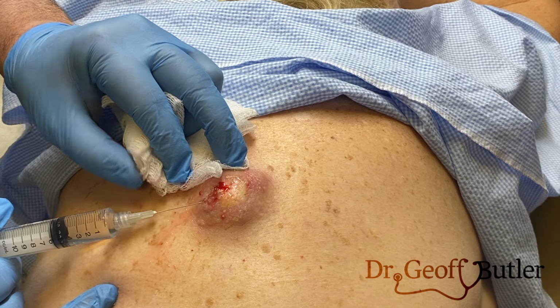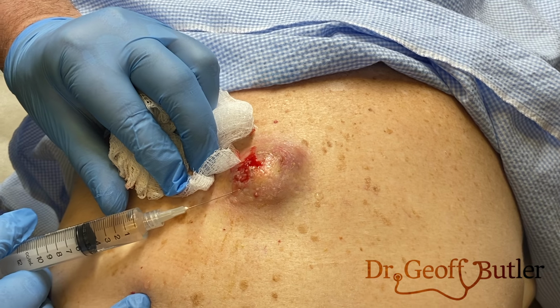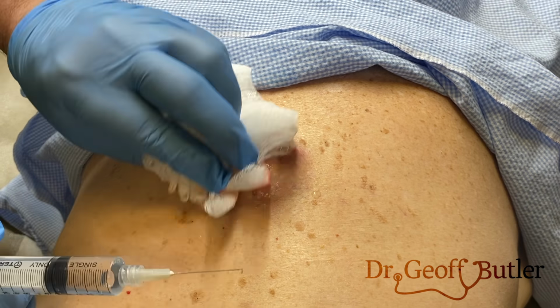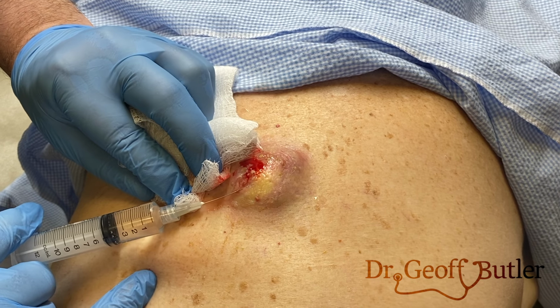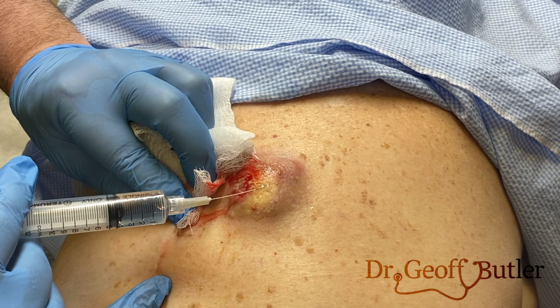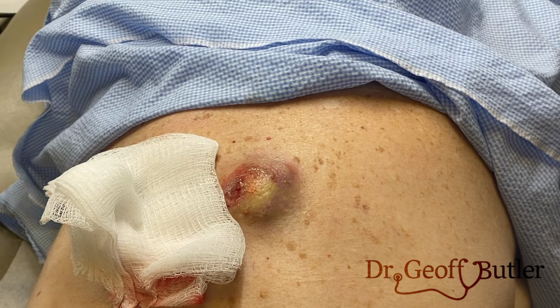Now you can ask yourself here, what about just doing a circumferential block all the way around? The difficulty is it's hard to see where the infection starts and stops, even though you think that visually it's just right here, but that's not always the case. So even those blocks don't work as well. So it just makes things a bit complicated for us. So once this is in, we're going to see if we can open this up a little bit.